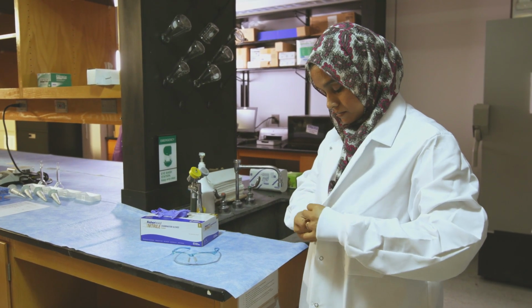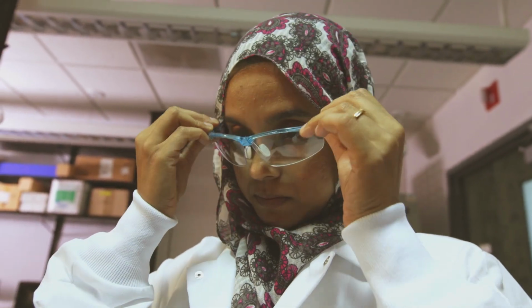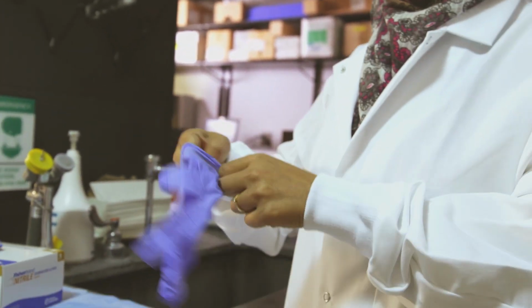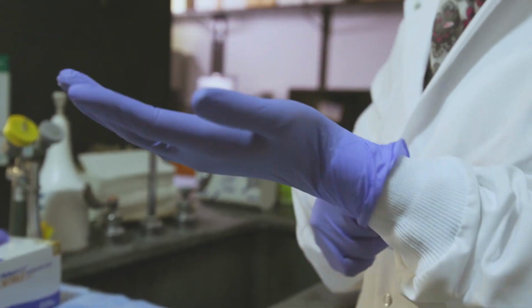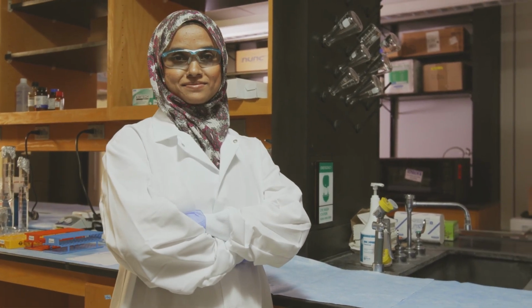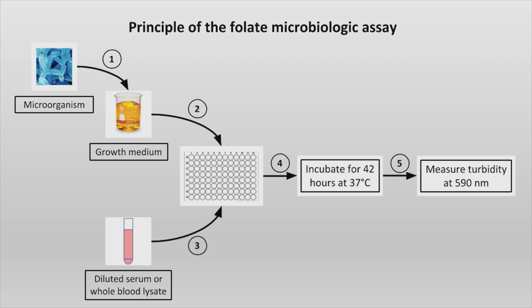Before we move on, please remember to consider all biological specimens to be potentially infectious. Therefore, it's critical that you observe universal precautions, wear appropriate protective personal equipment, and follow good laboratory practices when handling chemicals. Let's first review the principle of the Folate Microbiologic Assay.